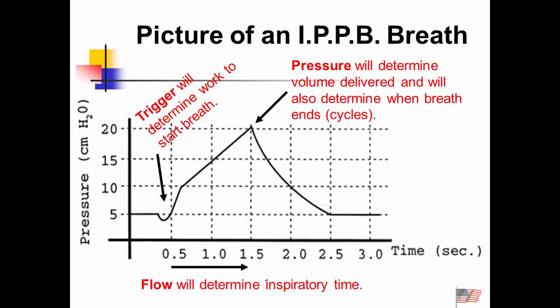In the ICU, we have ventilators that operate differently. They may be triggered by pressure, they may be triggered by flow, they may be triggered by time. But here we're just looking at something where it's going to be pressure triggered. And the flow continues until something else cycles it off, and that happens to be pressure also.